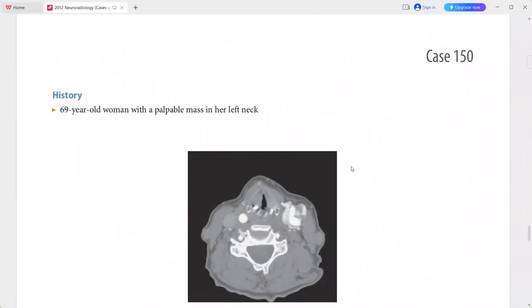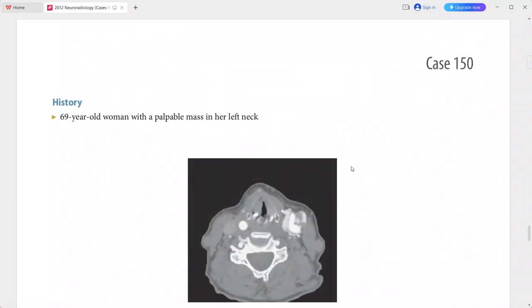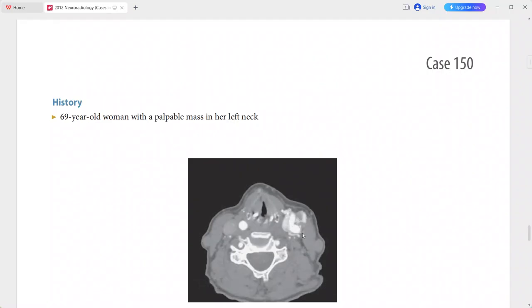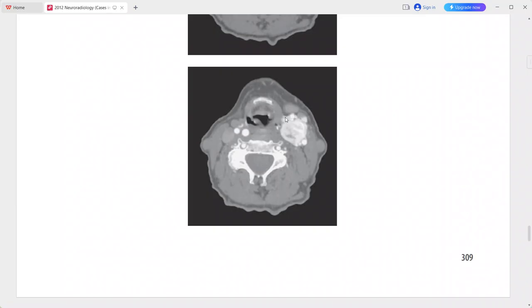Next is a 69-year-old woman presenting with a palpable mass in her left neck. CT angiogram axial images show an intensely enhancing mass at the carotid bifurcation. This mass is causing splaying of the internal and external carotid arteries, with marked enhancement even in the early arterial phase.